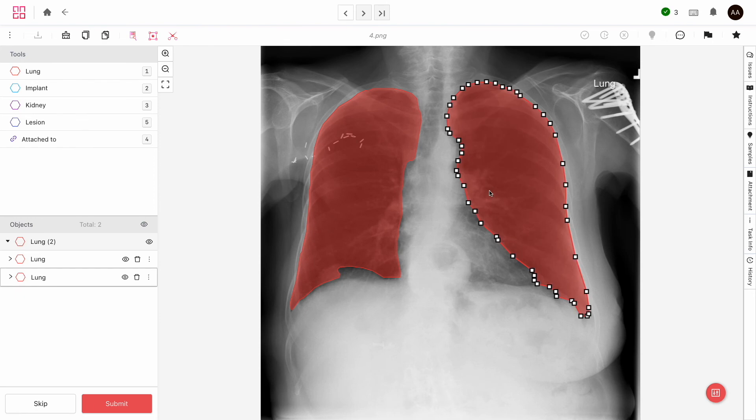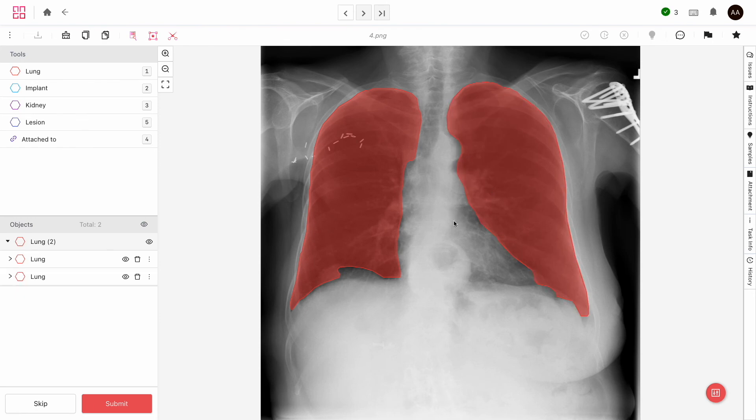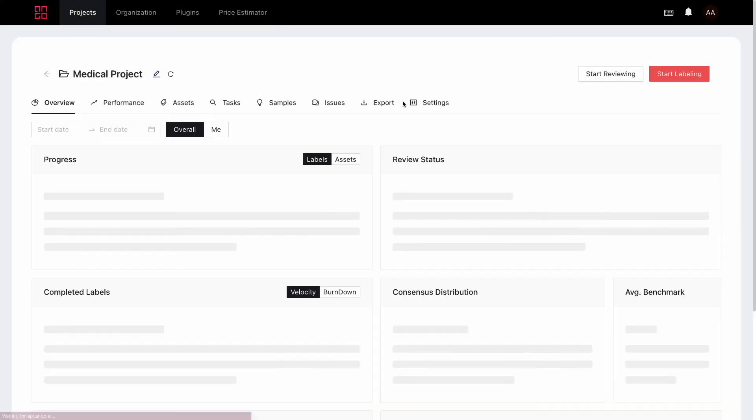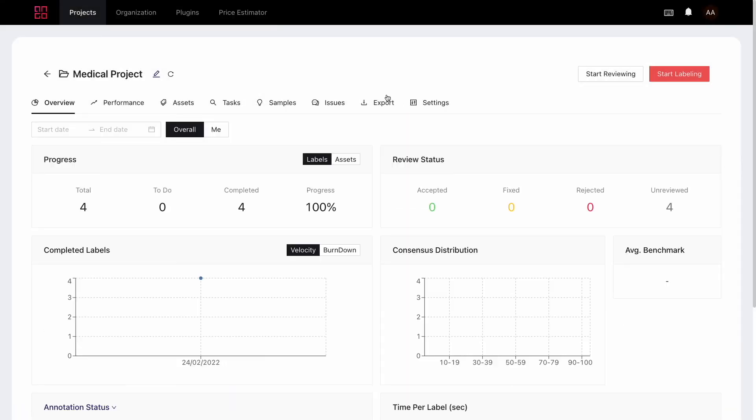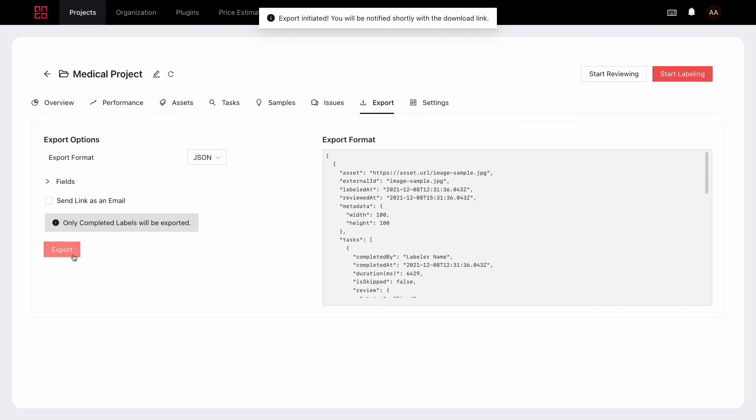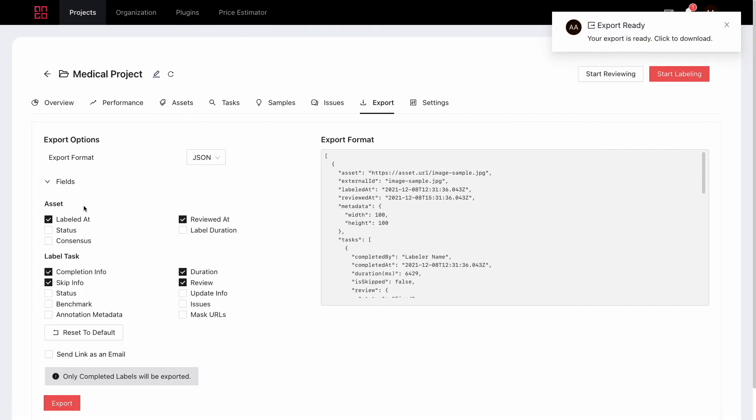Once you're done labeling, you'll of course want to export your annotations for you to use in your models. On Englehub, that couldn't be any easier. From your project, enter the Export tab and click on Export. You can tweak some parameters here depending on how much information you need, but for most cases, the defaults will work.